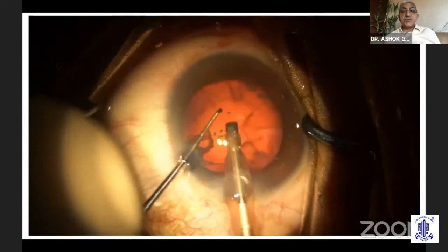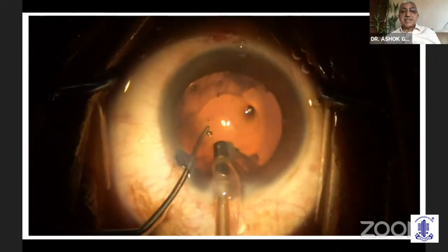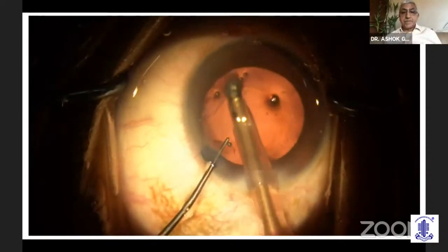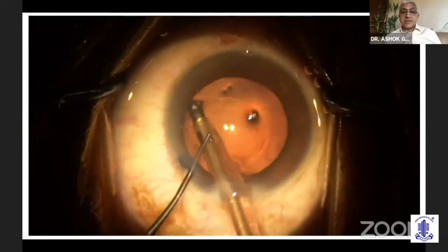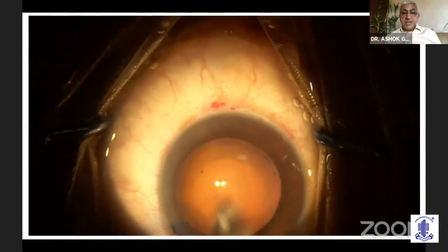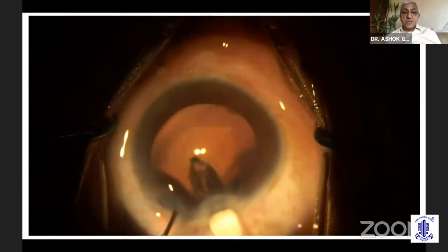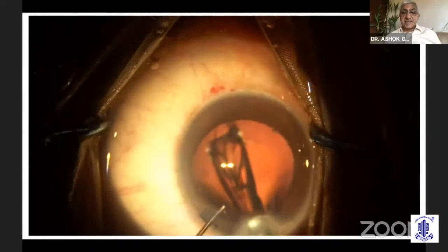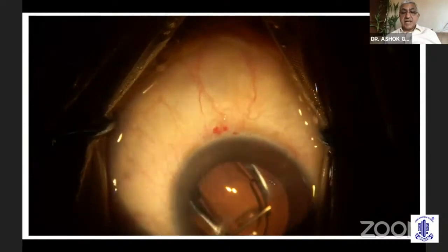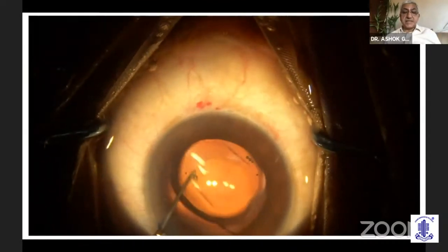So far so good. You can see that things are okay. And then I do my IA, staying away from the broken rhexis area till the end. I'm used to coaxial, so I do my coaxial, even though the other option is equally good. And now that things are stable, I will deepen the chamber and put in my lens. This is a single piece lens, which is preferable because the haptics will be softer, and I will keep the haptics away from the direction of the break of the rhexis.